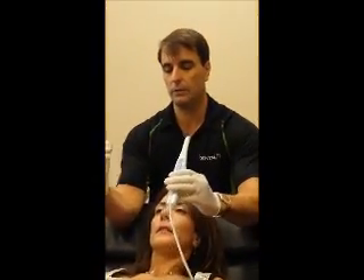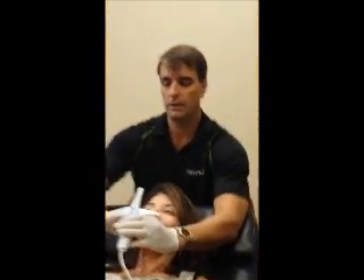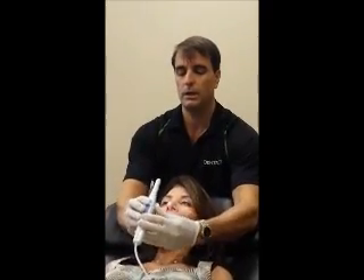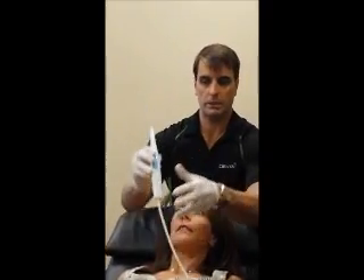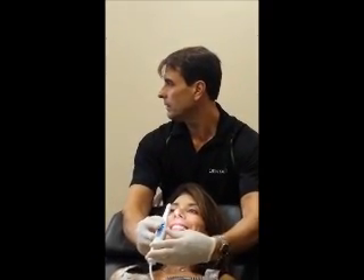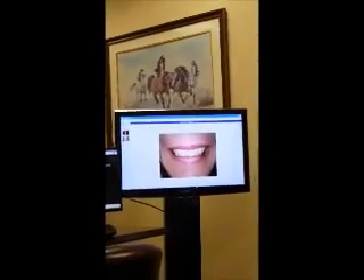Now, here for the smile shot, I'm behind the patient. If I had the headrest, I could put my elbows on the headrest. But in general, you're about a hand's width away from the patient. I like to hold the camera like this extra-orally for the smile shot where my fingers can get to the button. There you see the smile on the screen — I just froze that.